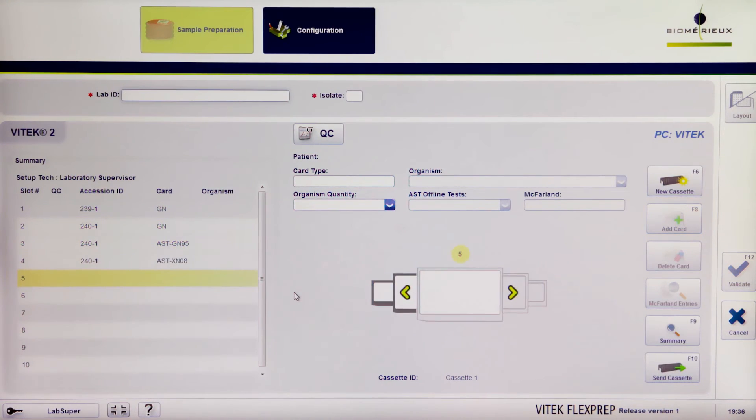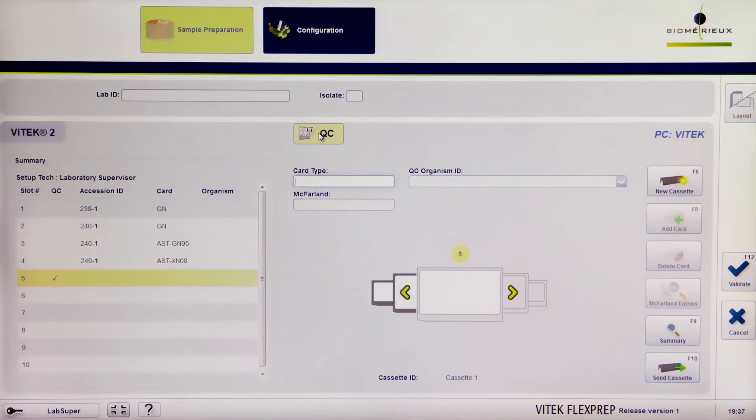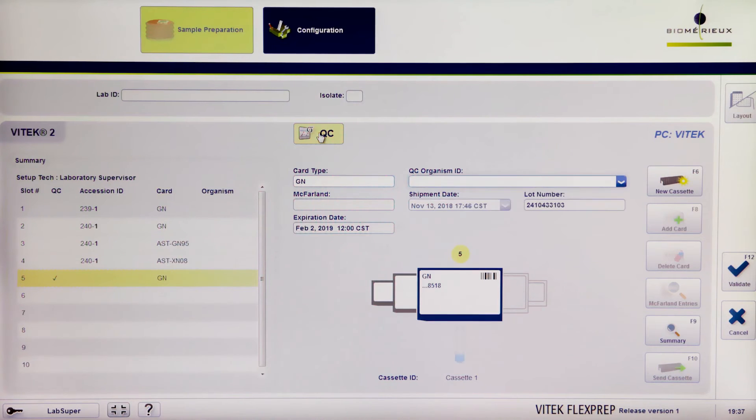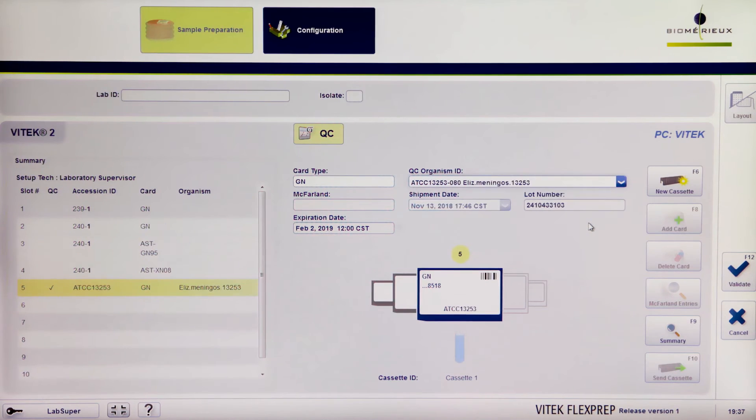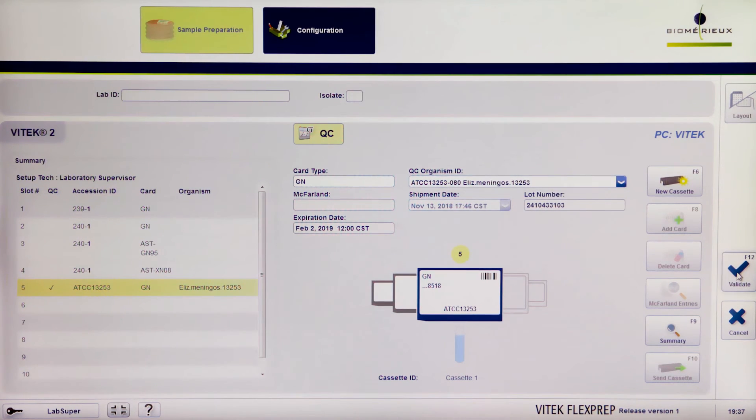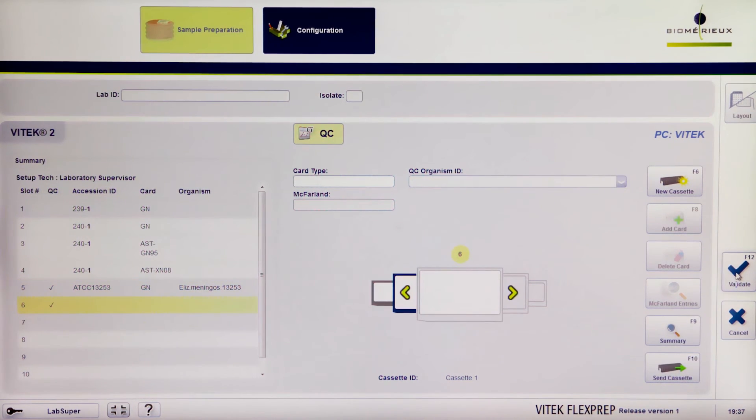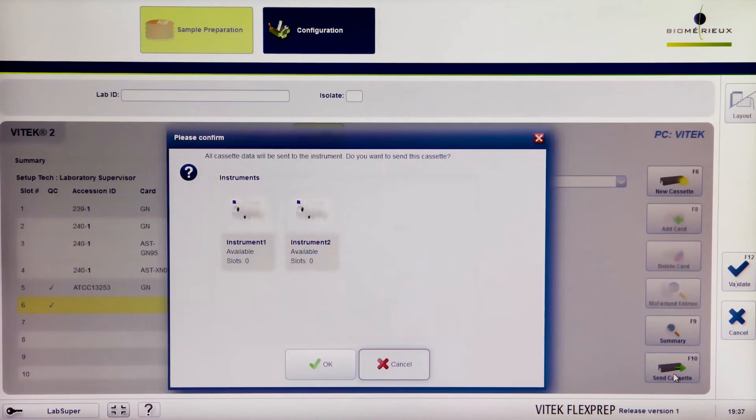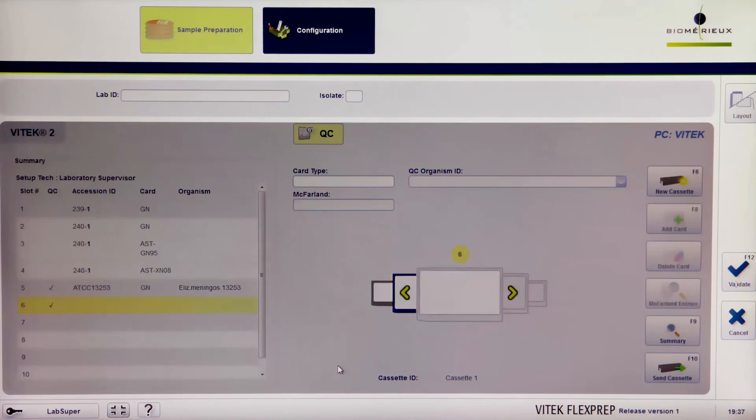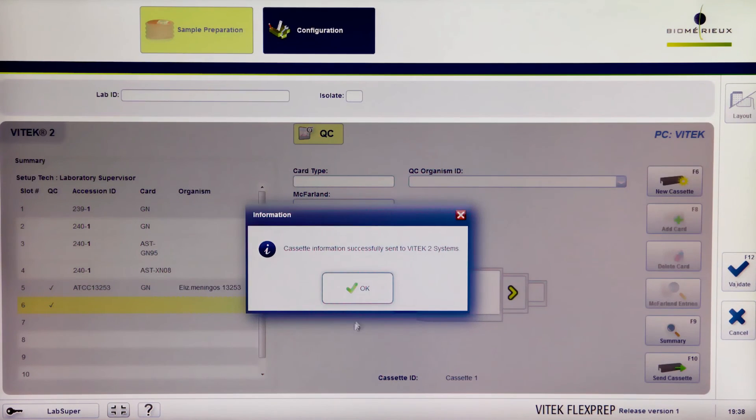To set up a card for QC, click the QC box, define the card, enter the QC Organism ID, and validate it. When all cards have been defined and isolates validated, click the Send Cassette icon. Press OK and confirm on both pop-ups.